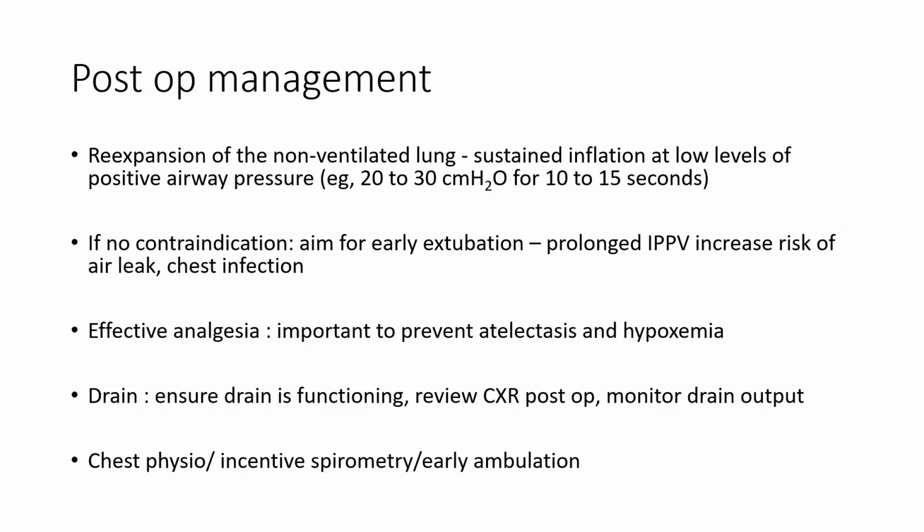So, post-op management: after the conclusion of the surgical procedure, we must always remember to re-expand the non-ventilated lung. So how do we do it? After suction of the non-ventilated lung, we can provide inflation with a low level of CPAP, about 20 to 30 cmH2O for about 10 seconds.